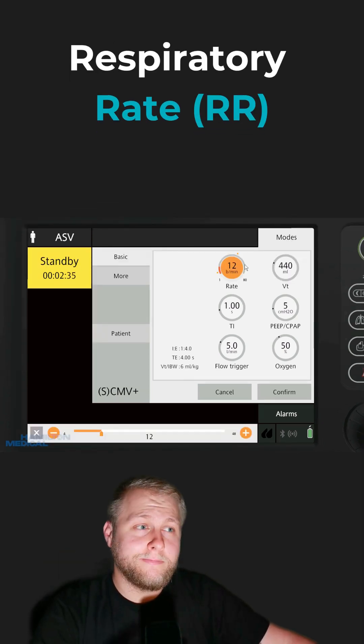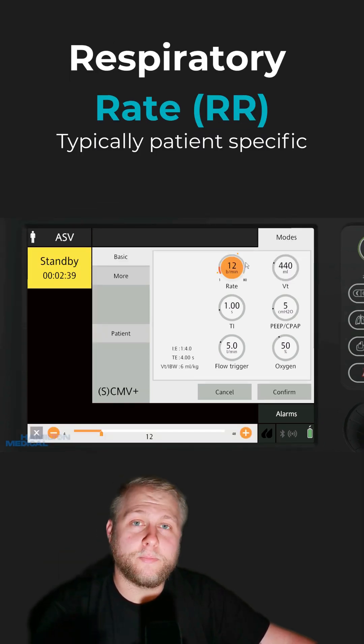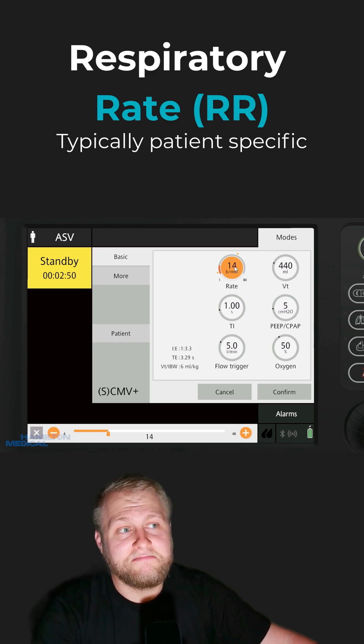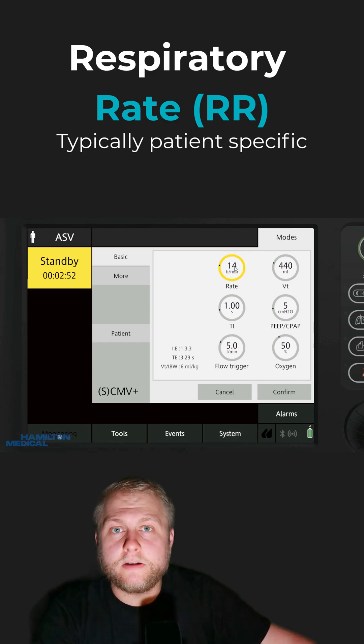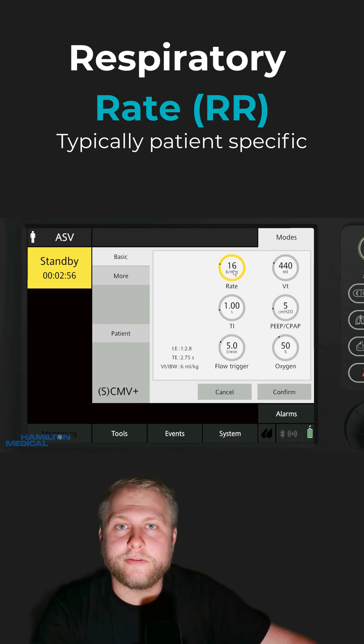Next, we got to determine our rate. Typically I'll look at what the patient's doing before I intubate them and put that rate on there. If they're breathing in their 20s and 30s, I might go a little higher than if they were breathing around 12 times a minute. Anywhere from 12 to 16 — just a normal breath rate — should be all right.